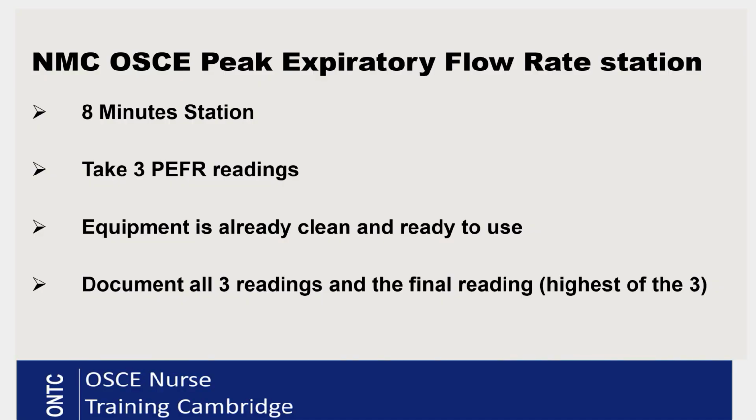So let's talk about the PEF reading, peak expiratory flow reading. It's your 8-minute station in your exam, and they have changed the marking criteria recently a little bit for this station. So I'm just going to be showing you according to the latest, the new marking criteria, which is on the test centers, and I've also attached the copy to the description of this video below.